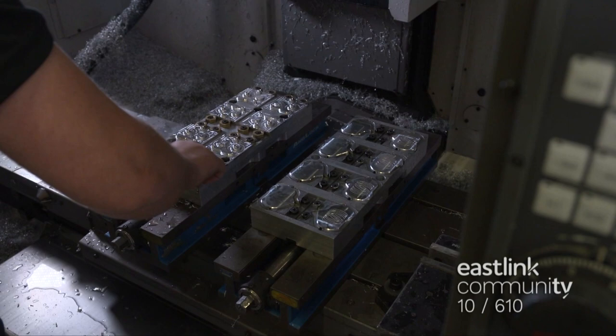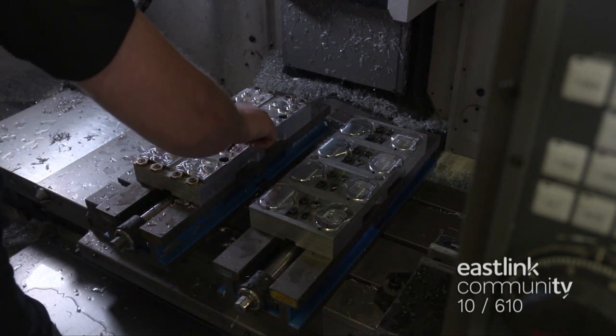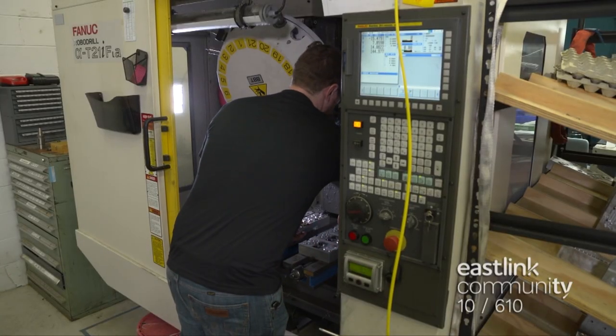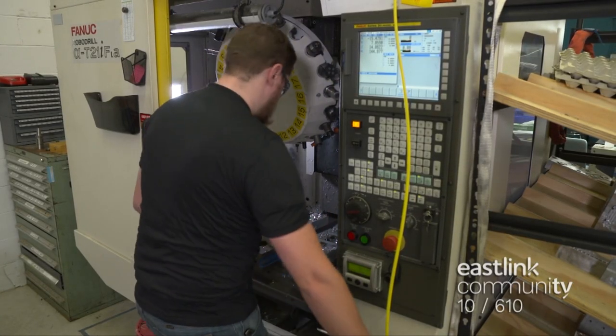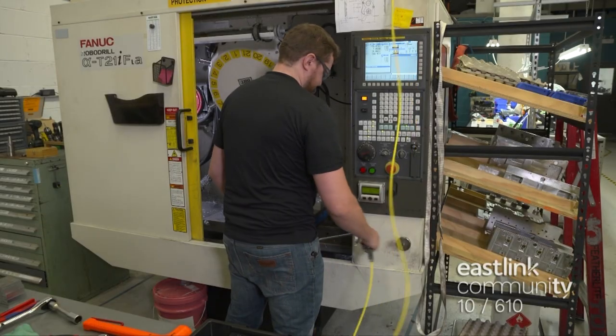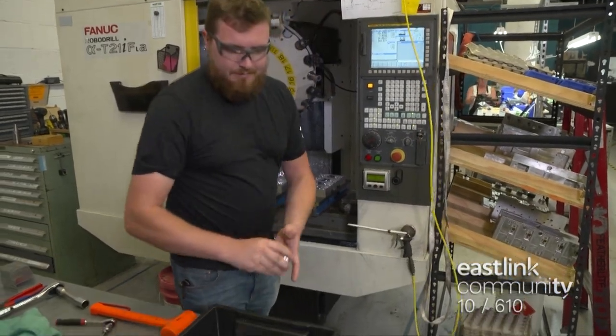Once finished, the jaws are loosened and the cap is ready to be cut on the other side. The finished caps are removed, cleaned, and stored until they are sent off-site to be anodized.